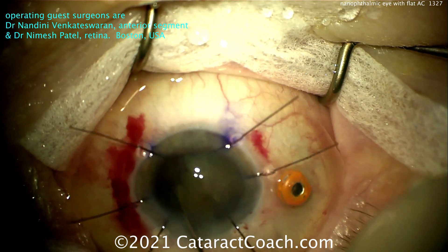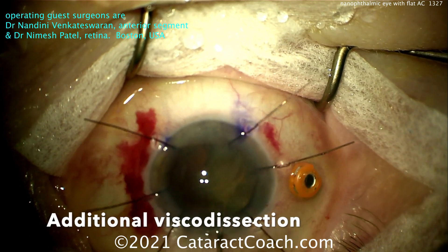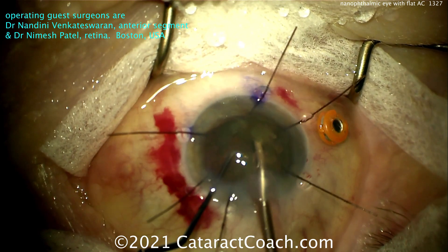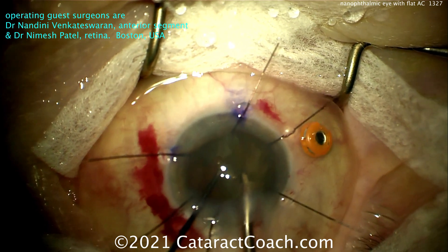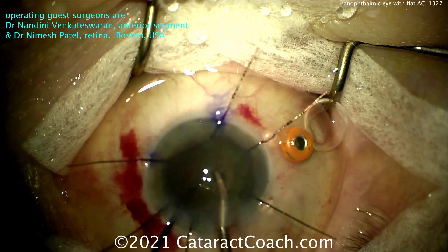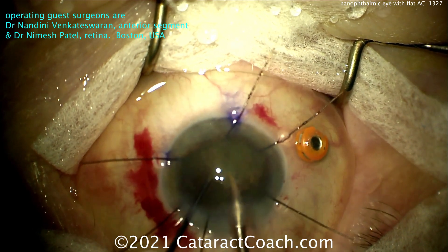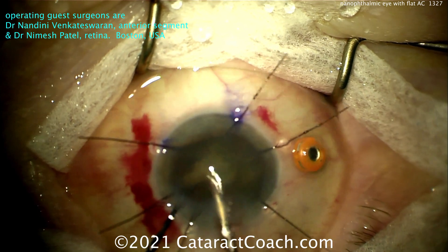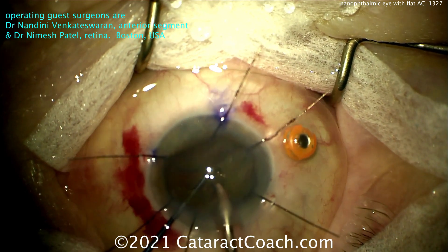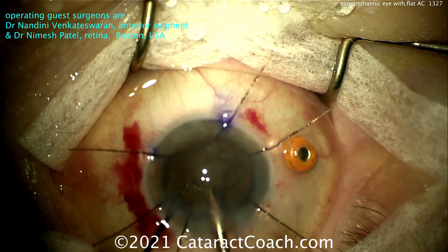My technique, if I'm going to do a little pars plana vitrectomy, is to make a paracentesis — in one hand have the vitrector through the pars plana, and in the other hand put in a viscoelastic cannula to slightly deepen the AC. Right hand: a little vitrectomy, just two to four seconds. Then left hand: inject a little more viscoelastic. Go back to the right hand, a little more vitrectomy; then left hand, a little more viscoelastic — until I get the AC depth I want. If you take out too much vitreous in a small 19mm eye, you may end up with an overly deep anterior chamber, and you don't want that either.